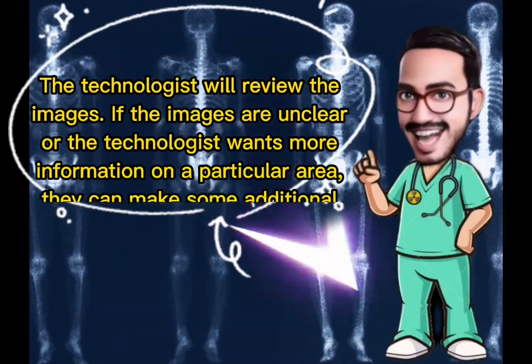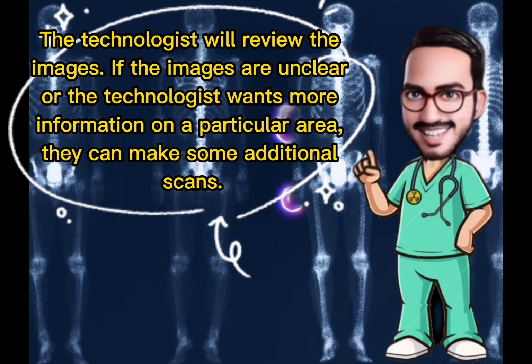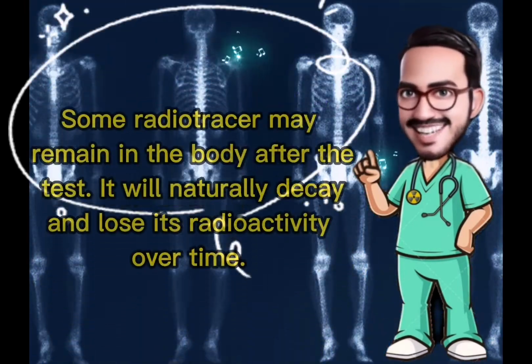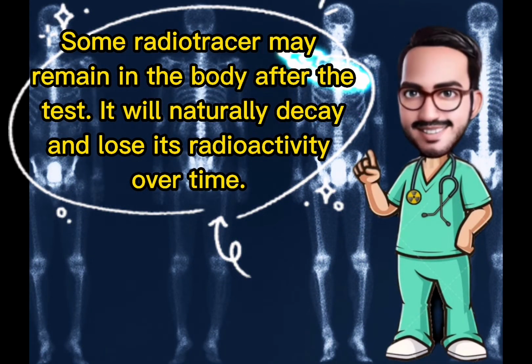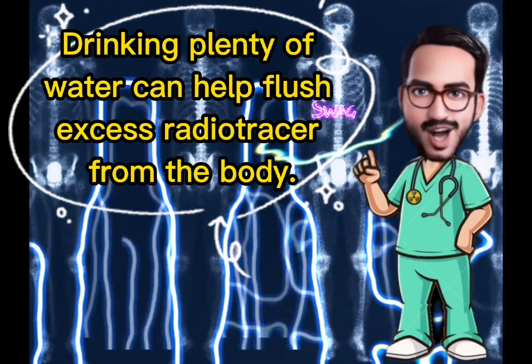The technologist will review the images. If the images are unclear or the technologist wants more information on a particular area, they can make some additional scans. Some radiotracer may remain in the body after the test. It will naturally decay and lose its radioactivity over time. Drinking plenty of water can help flush excess radiotracer from the body.